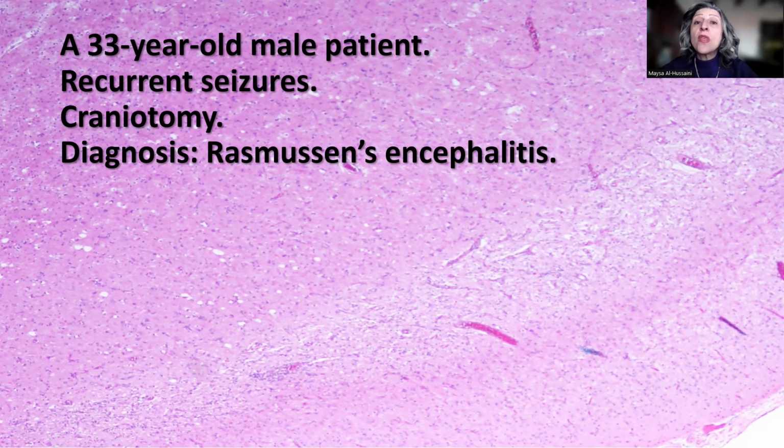So the final diagnosis in this case, in consideration of the clinical history as well as in correlation with the radiological findings, is that this is an inflammatory process, not a neoplastic process, and would be consistent with Rasmussen's encephalitis. Remember that Rasmussen's encephalitis occurs primarily in children who present with chronic seizures, but yet can be seen in adolescents and adults, as in this case, which makes the consideration for the diagnosis more difficult.